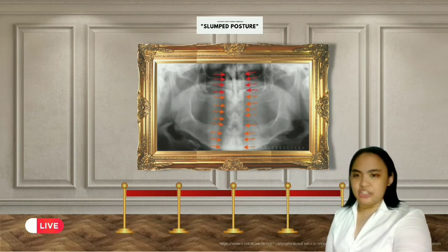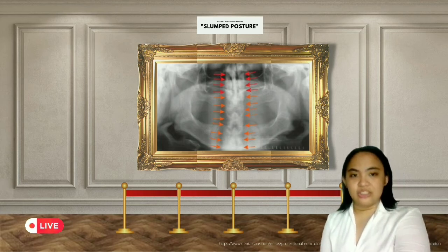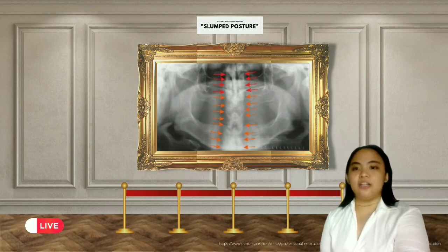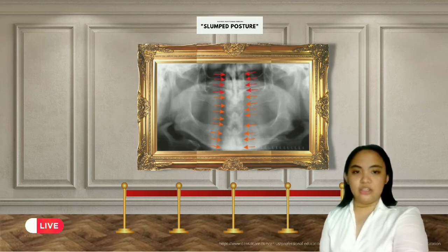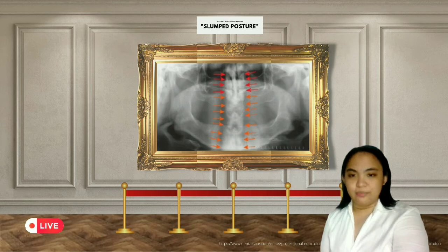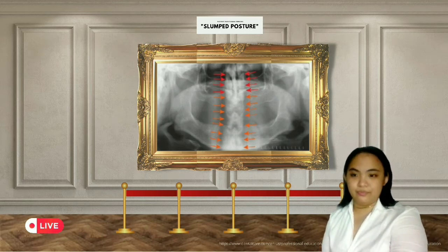To prevent such an error, the dental radiographer must instruct the patient to stand or sit as tall as possible with a straight back. An additional instruction to the patient must include stepping forward slightly closer to the machine. This movement has the effect of straightening the cervical spine.